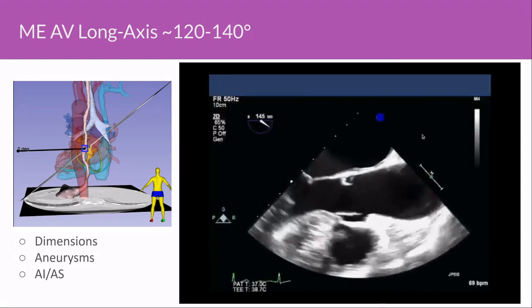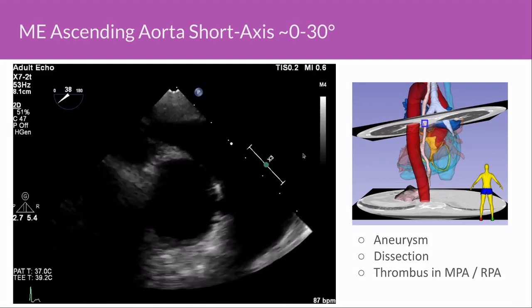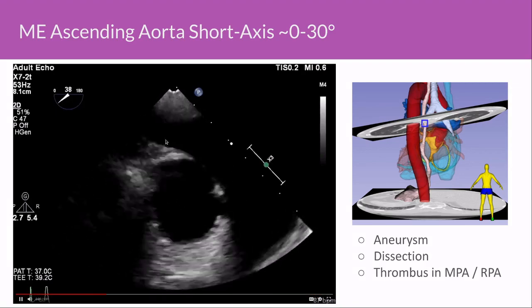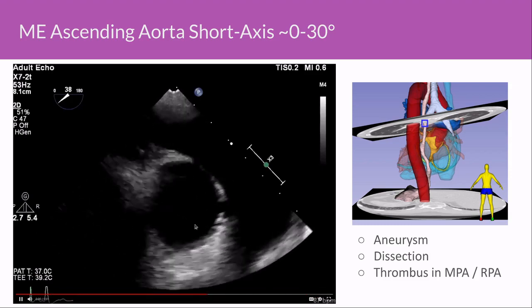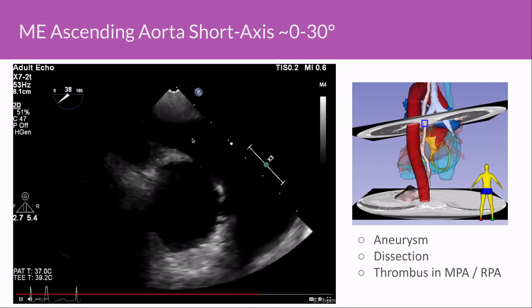Here is a normal example. By pulling the probe up a little bit, we obtain the mid-esophageal ascending aorta views. In the short axis view, you can see the main pulmonary artery and the RPA. Sometimes you can also visualize part of the LPA by rotating left. We have the proximal ascending aorta, and next to it the SVC. In this view you would see large aneurysms, dissections, and potentially large thrombi in the pulmonary artery.